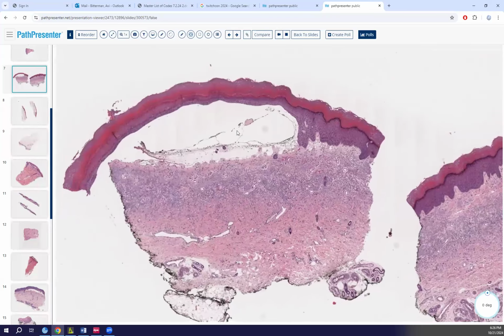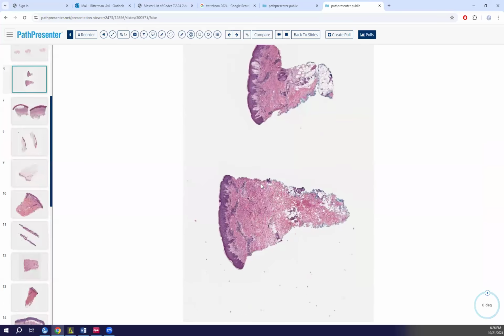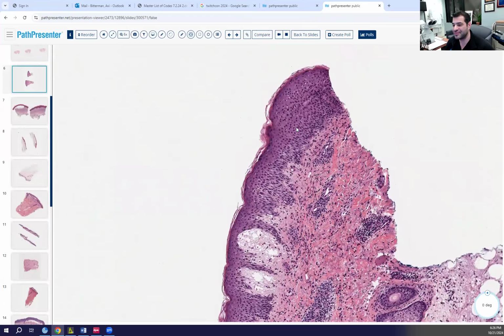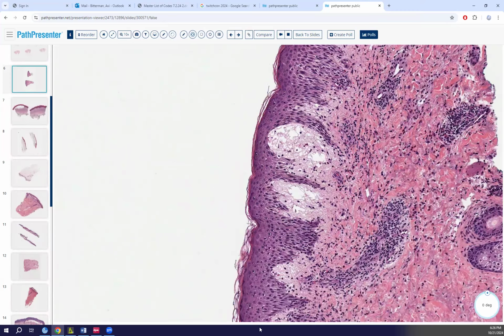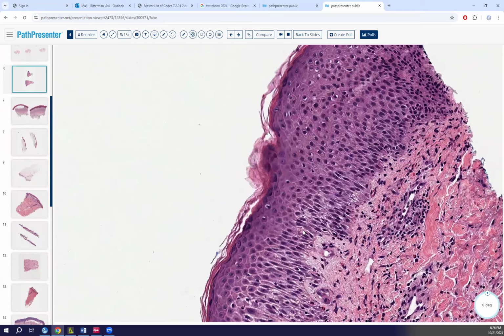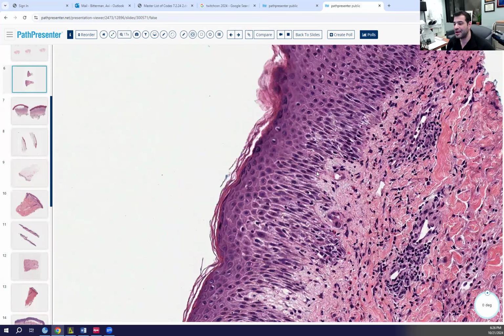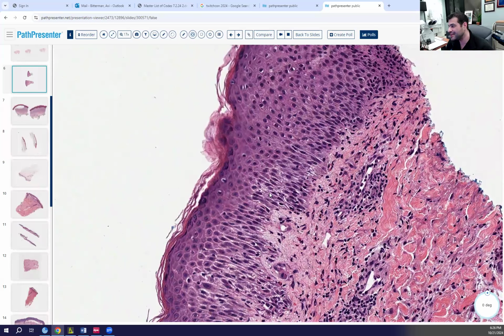Do you know the clue for IP in that situation? If there are whorls of necrotic keratinocytes? Yes, dyskeratotic keratinocytes with that background can get you to IP on a test, especially eosinophilic spongiosis with necrotic keratinocytes.